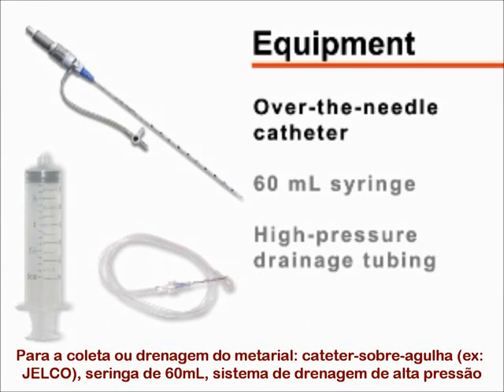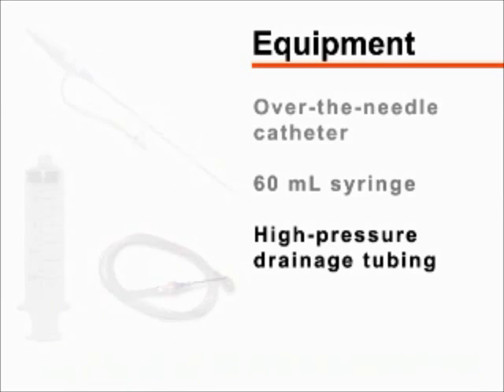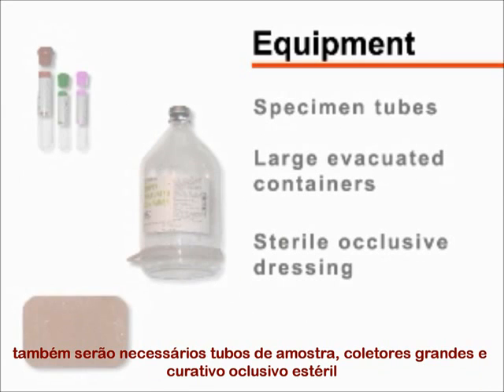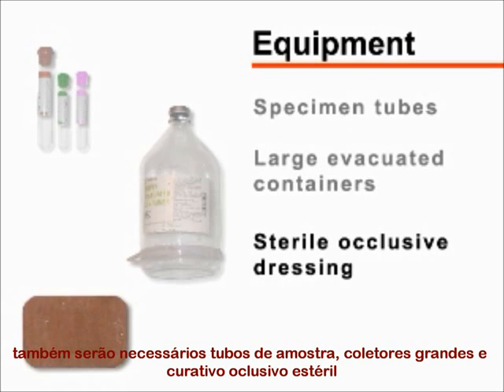For collection of ascitic fluid, you will need an over-the-needle catheter device, a 60 milliliter syringe, and high-pressure drainage tubing. You will also need specimen tubes, large evacuated containers, and a sterile occlusive dressing.